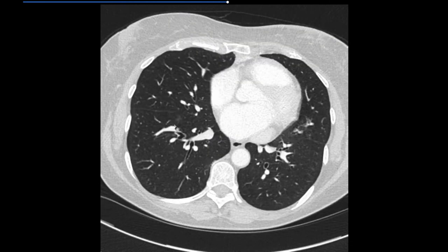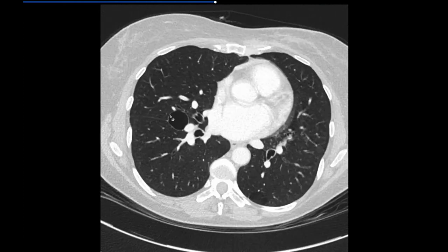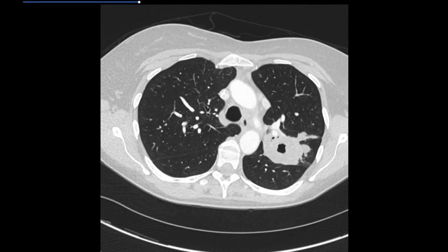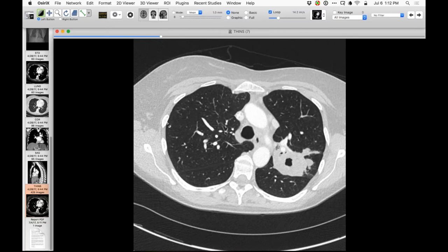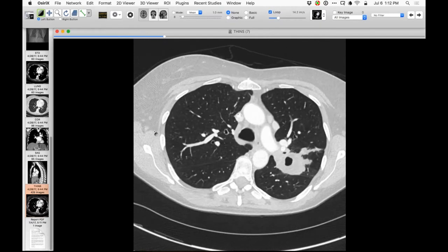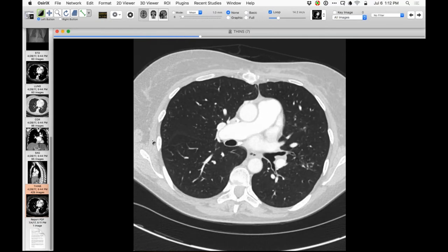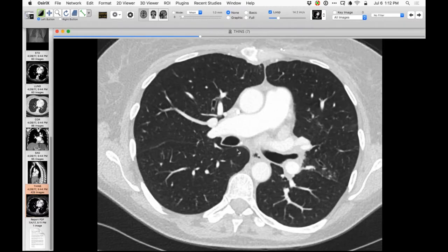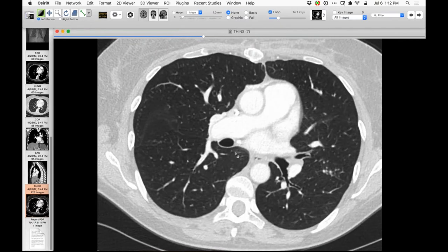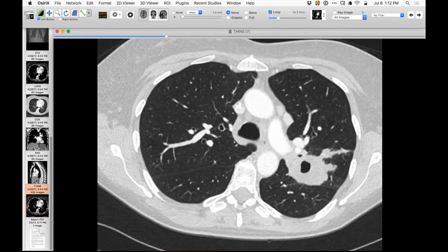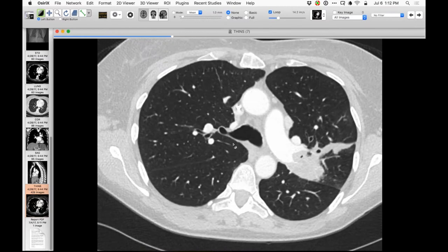The combination of cavitation and intraluminal material is certainly not suggestive of metastatic breast cancer as an isolated lesion. This person turns out on culture and PCR to have tuberculosis - so this is tuberculosis as an unanticipated finding in a person with breast cancer. It's cavitary necrotizing tuberculosis. There are some calcifications - possibly from remote tuberculosis or some other non-tuberculous granulomatous infection.